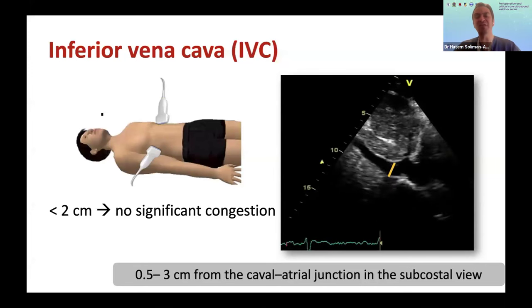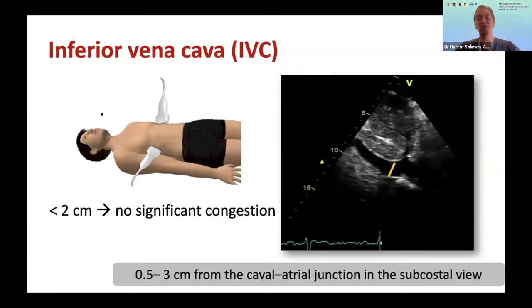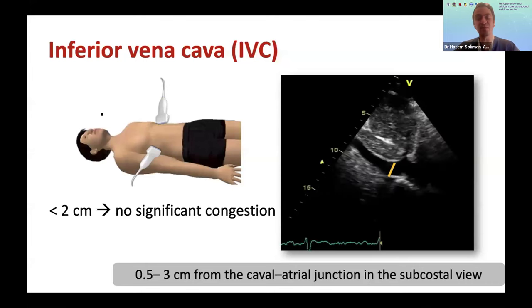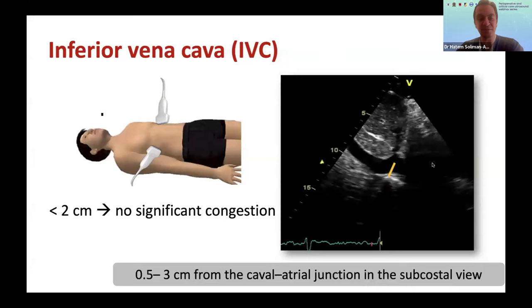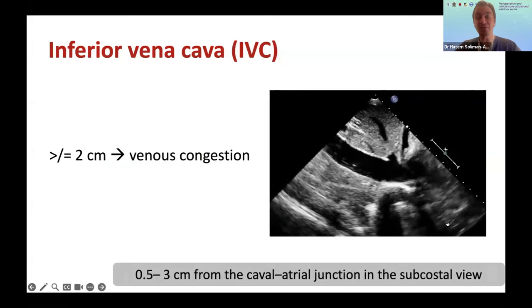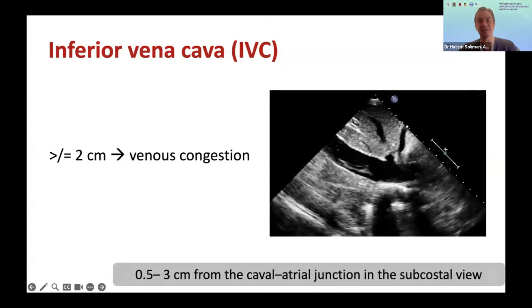The study tells us if the IVC is not dilated, you don't need to proceed further and do VExUS, because you will be very unlikely to have systemic venous congestion with a non-dilated IVC. However, I recommend doing the rest of the protocol anyway, because I believe all these parameters are like pieces of a jigsaw puzzle. The more pieces I have, hopefully the clearer the picture becomes. Obviously, if the IVC is dilated, there might be congestion, there might not. This is regardless of mechanical ventilation, by the way, because in the study almost 50% of the patients were spontaneously breathing and the other 50% were mechanically ventilated.